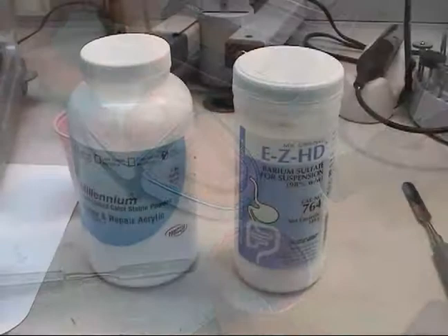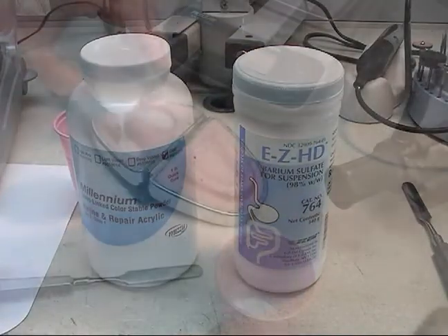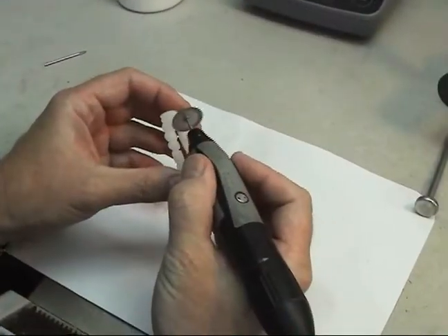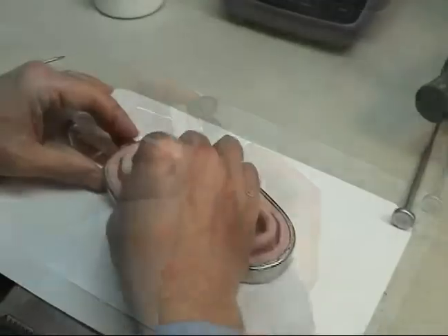A mixture of 30% barium sulfate and acrylic resin was poured into the tooth portion of the mold. After setting, the tooth portion was removed, trimmed, and reinserted into the mold.